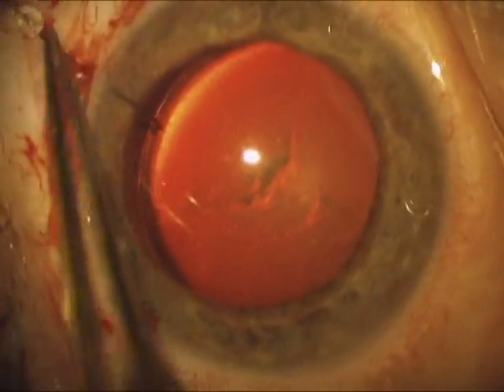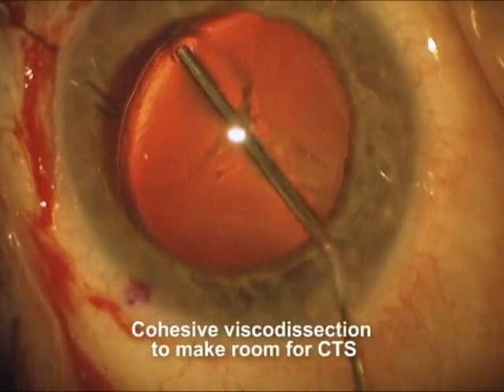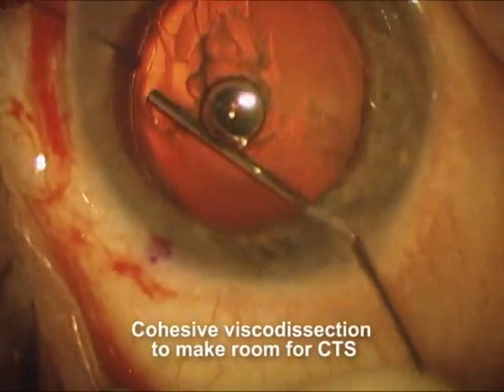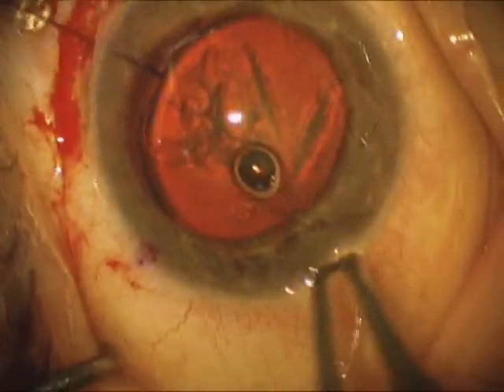Now the hook is in place and ready. We're going to prepare for the capsular tension segment by using some cohesive visco dissection. In this case we're using Provisc, and we're getting ready to place the capsular tension segment in this area. We're trying to get a dissection plane between the capsule and the lens.